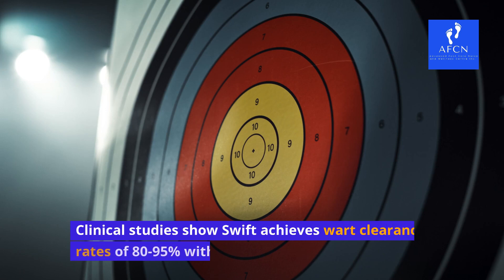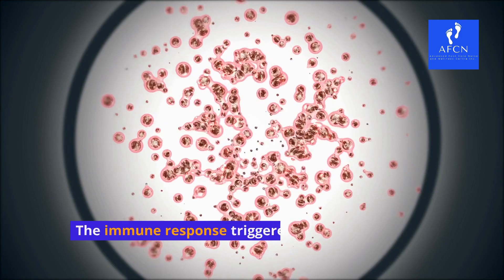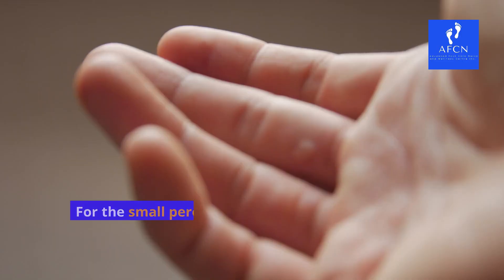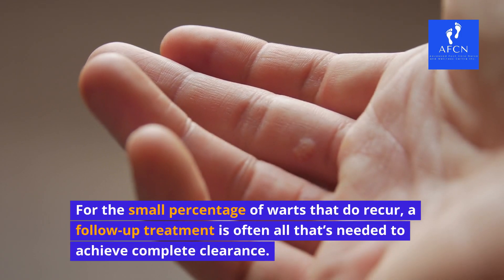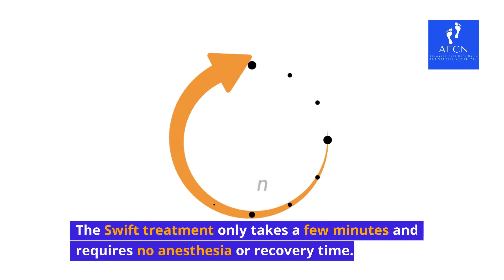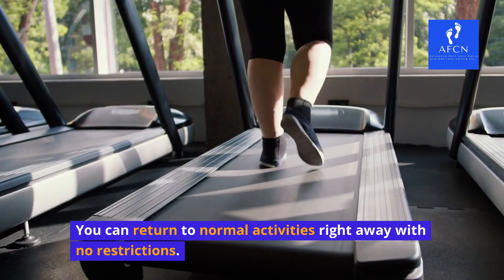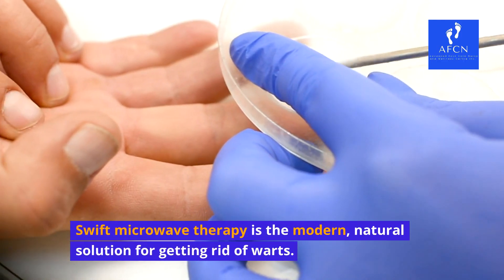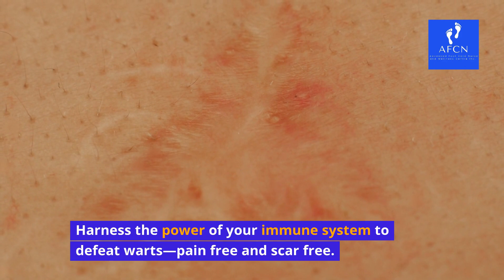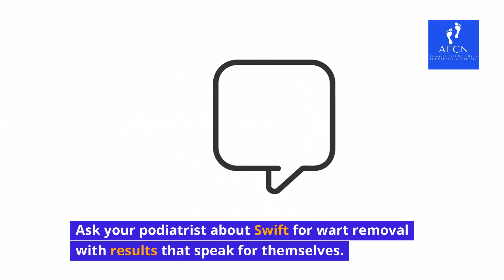High success rate. Clinical studies show Swift achieves wart clearance rates of 80–95% with a single treatment. The immune response triggered by the microwave therapy is very effective at eliminating wart tissue. For the small percentage of warts that do recur, a follow-up treatment is often all that's needed to achieve complete clearance. The Swift treatment only takes a few minutes and requires no anesthesia or recovery time. You can return to normal activities right away with no restrictions. Swift microwave therapy is the modern, natural solution for getting rid of warts — harness the power of your immune system to defeat warts, pain-free and scar-free.